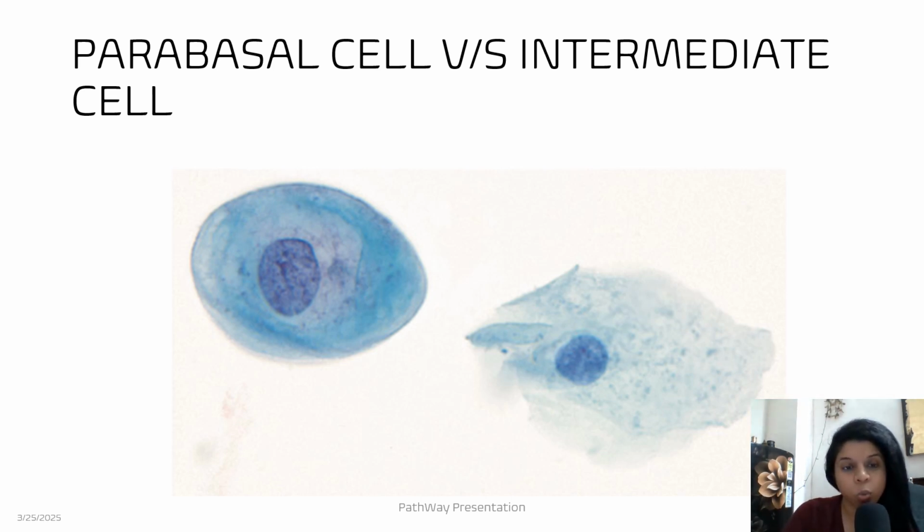You can see how well defined the cytoplasmic borders are, round to almost oval, and see the cytoplasm here. There is a non-uniformity, that is, it is dense here and not at all dense here. Here there is almost very uniform cytoplasm and a very flattened appearance.